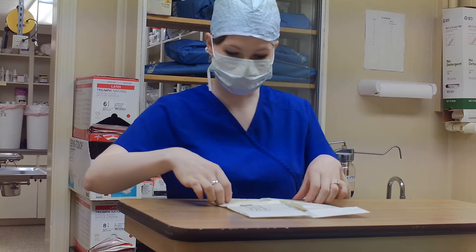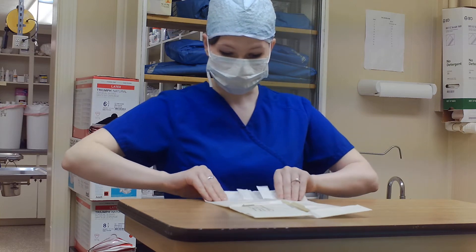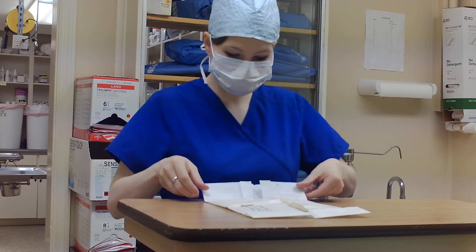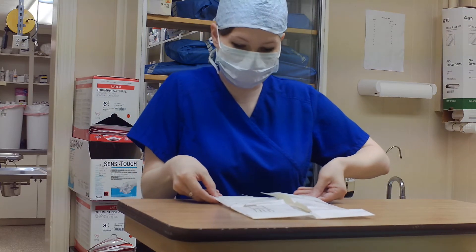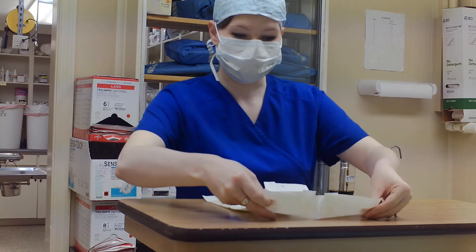This part you can touch on the outside to prepare for the sterile personnel who is gloving in. So I'm going to fold these back. Sometimes I like to kind of over-exaggerate the folds so that way I make it stay a little better. And do the same thing on the other side.